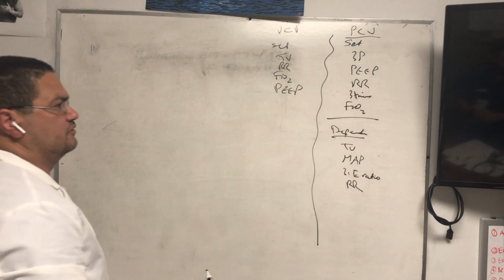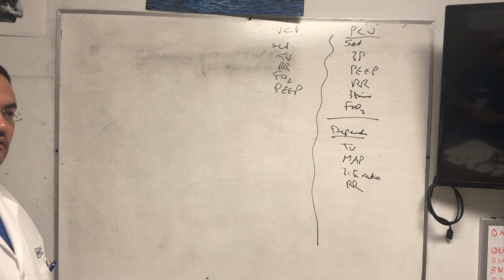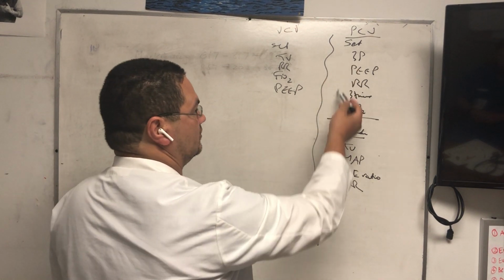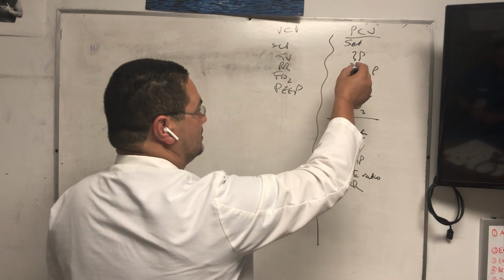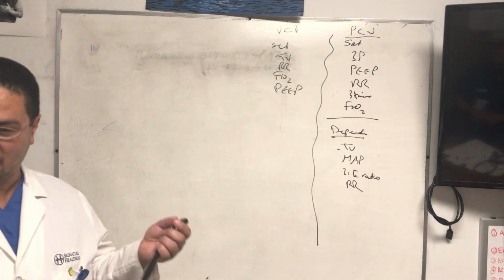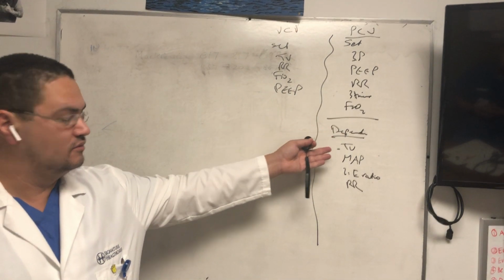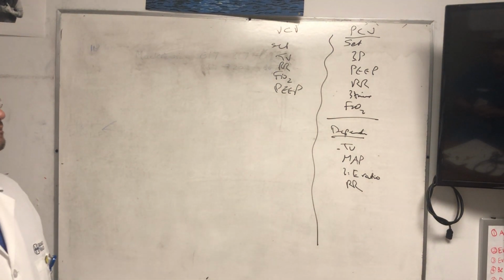So, some myths of pressure control. People just don't understand pressure control very well. For example, somebody comes and tells me, I have a patient on pressure control, the settings are tidal volume so-and-so, respiratory rate so-and-so. Did I mention tidal volume as a set parameter? No. If this is the first thing you're telling me, that means you know nothing about pressure control, right? You tell me the set parameters, and if you want to say the tidal volume, you say that it results in a tidal volume of such and such, and maybe a mean airway pressure of such and such. That's number one.